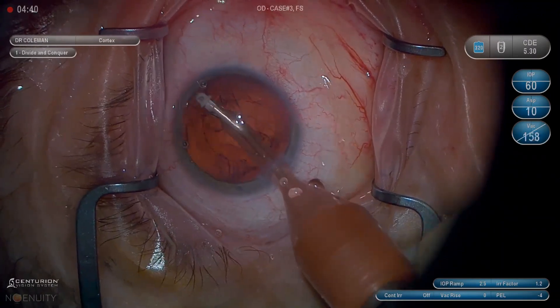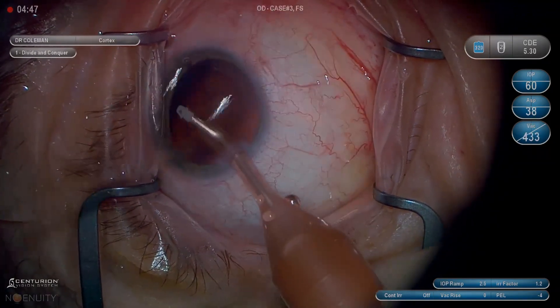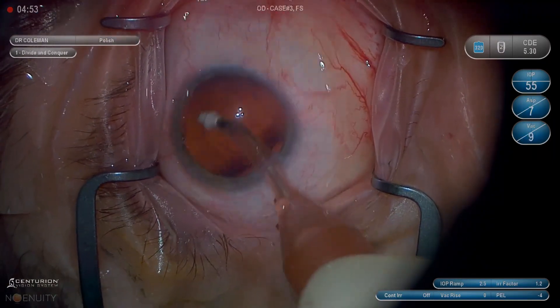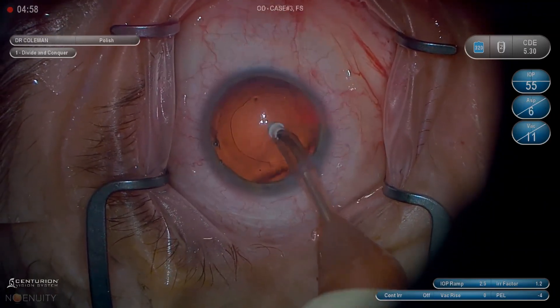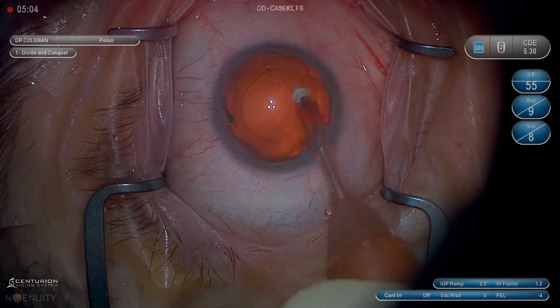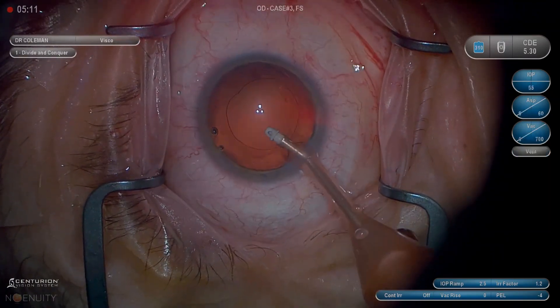If you want to know how long each step takes, divide the total time by ten — that's my average time over a 10,000-case series. Starting out with cortex removal, the first thing I'm going to do is make sure my sleeve is in a good position. If the tech hasn't gotten it in a good position, where there's a small amount of overlap of the pink sleeve on the polymer tip, I'm going to stop and do that. It should have a little bit of overlap — not right up to the collar, but a little overlap is good. That's going to get the fluid flowing the way you want and give you a nice stable chamber. I think it's worth the time.